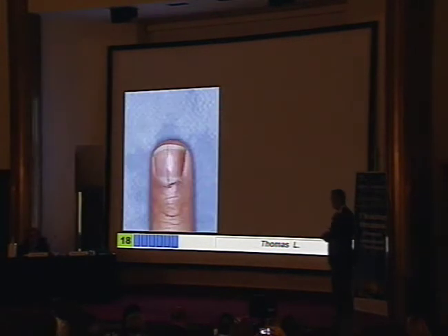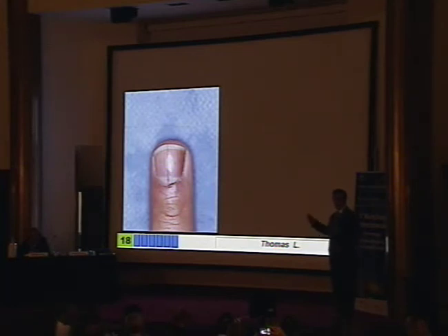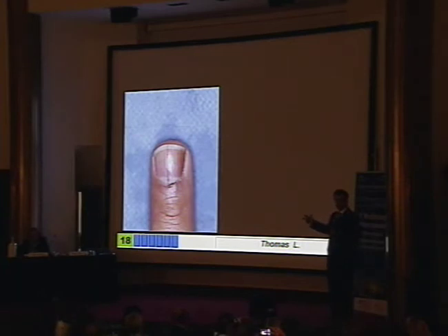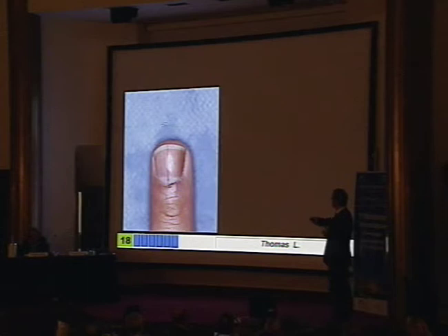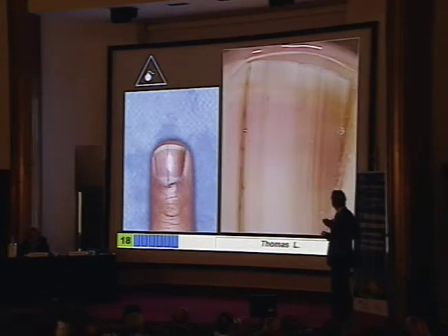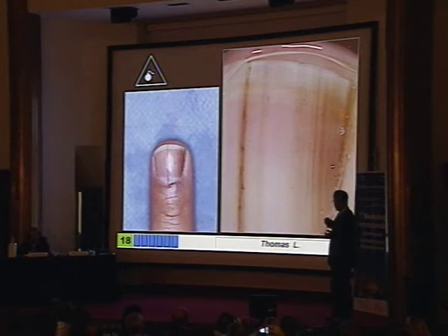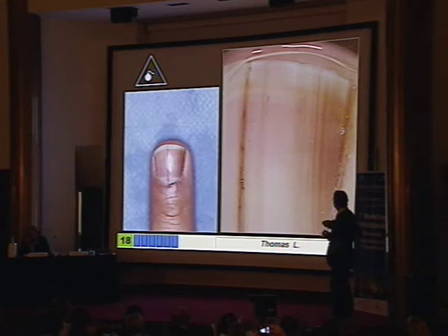But be careful — always use your dermoscope. This patient may not look frightening clinically. Would you perform a biopsy for this lesion? But if you use dermoscopy, you will see that there are many lines, and these lines are irregular in their pigmentation, in their spacing, and in their thickness. And this was melanoma.